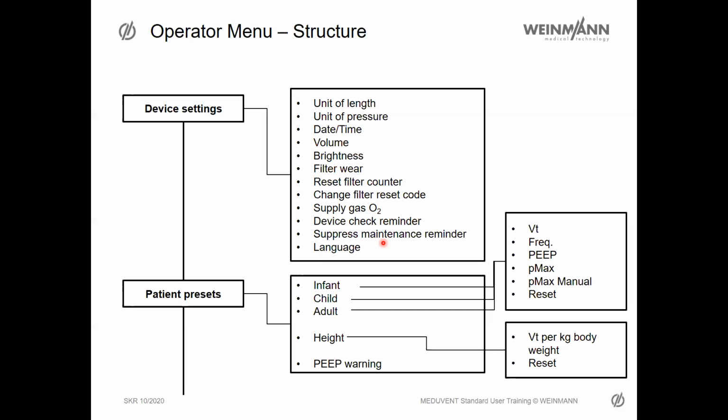When you don't need this, you can deactivate it so the user doesn't get a reminder to check this device. You can suppress the maintenance reminder one time, and you can change the language in this operator menu structure.